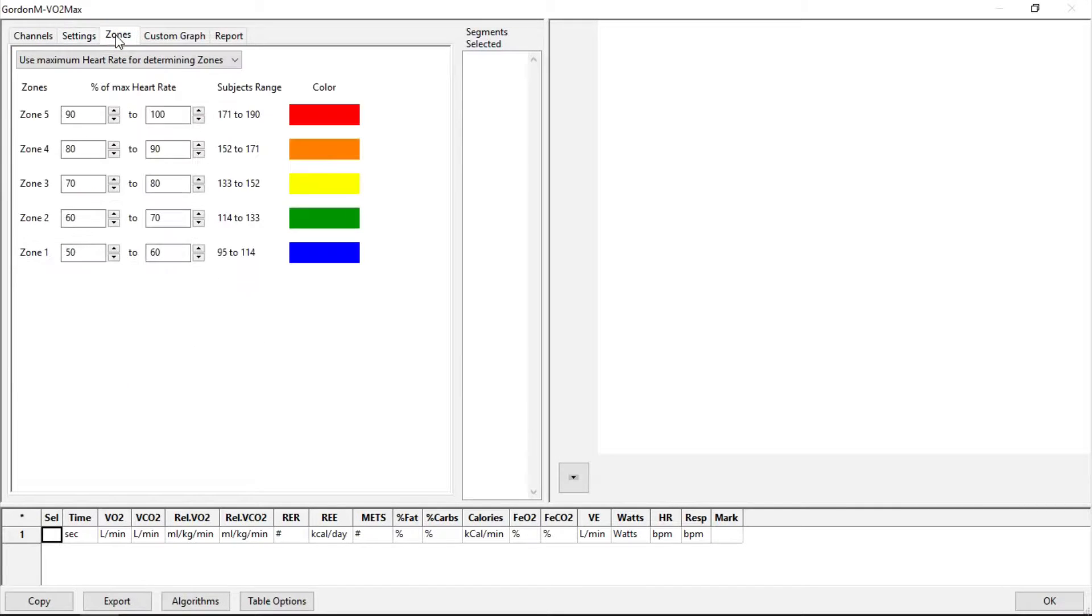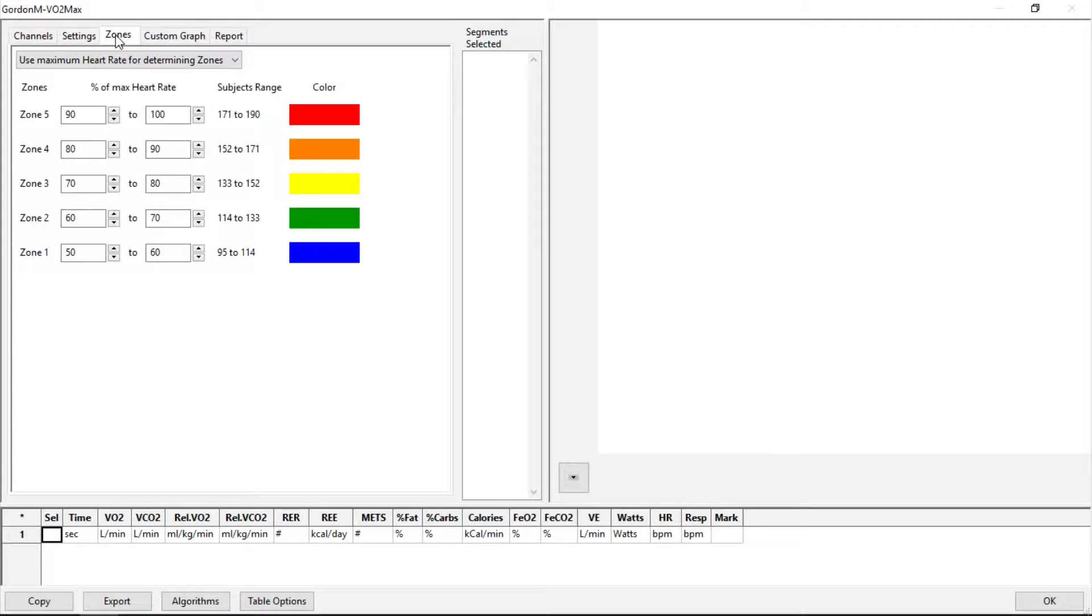Going over to Zones, we can set various zones for color coding. We can customize the graph, and we can generate a report.